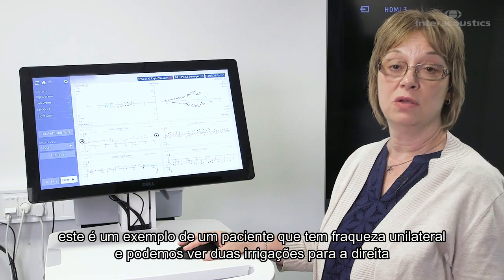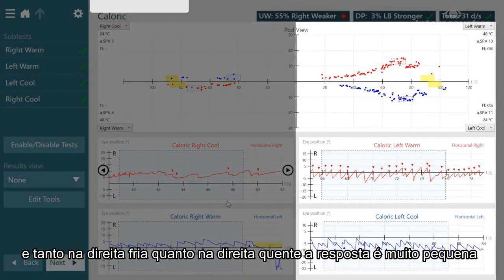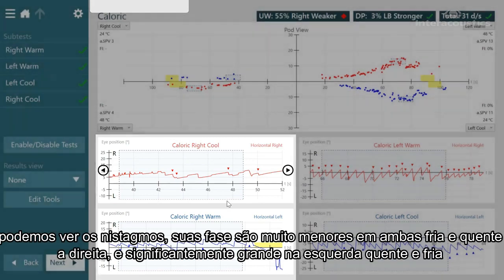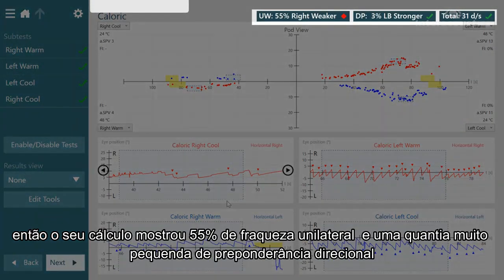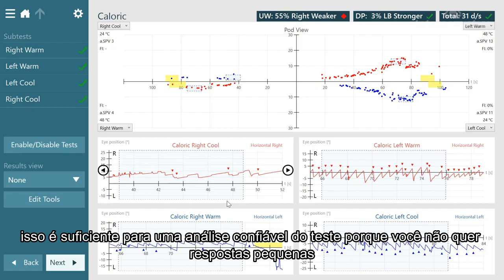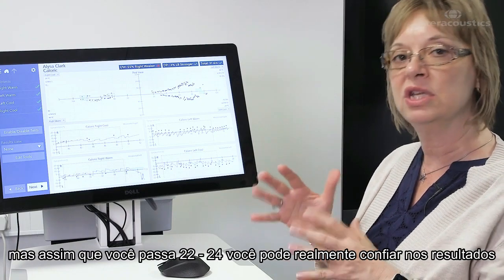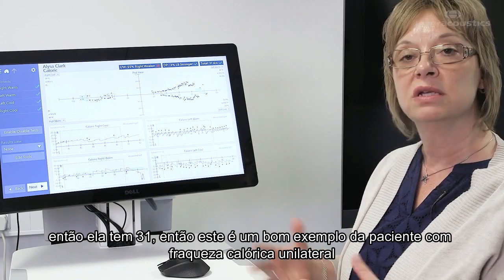This is an example of a patient that has a unilateral caloric weakness. We can see her two right irrigations — the right cool and the right warm — her responses are very small compared to her responses on the left side, where her responses were much larger. The nystagmus slow phases are very small with both right cool and right warm, and significantly larger with left warm and left cool. Her calculation shows a 55% unilateral weakness, and a very small amount of directional preponderance — so it's a pure right caloric weakness. She has 31 degrees of overall nystagmus, which is enough to reliably analyze the test. Once you get past 22 or 24 degrees, you can really rely on the results. So this is a nice example of a patient with a right unilateral caloric weakness.